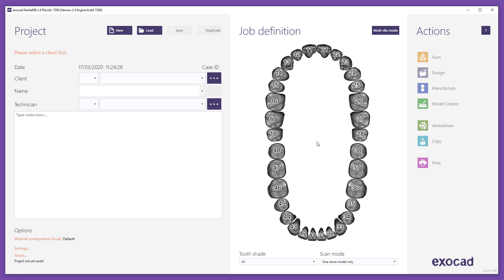To start, launch ExoCAD DentalDB and load an existing job.